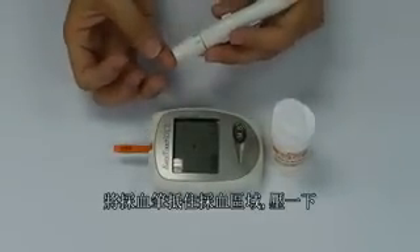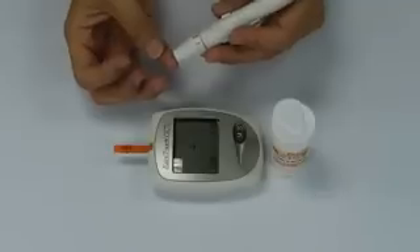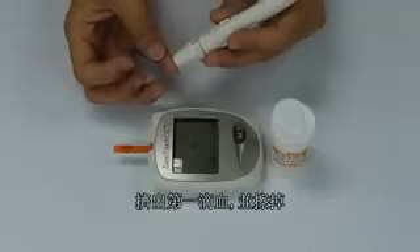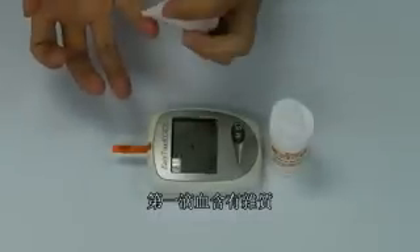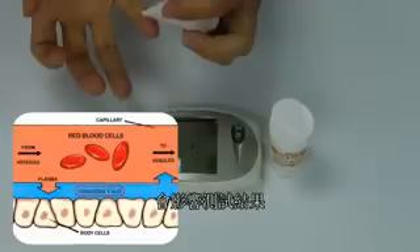Place the tip of the lancing device on the lancing site and press the trigger. Squeeze out a small sample of blood and wipe it away with a clean tissue. This first drop contains interstitial fluid, which significantly affects the results and should not be used for testing.